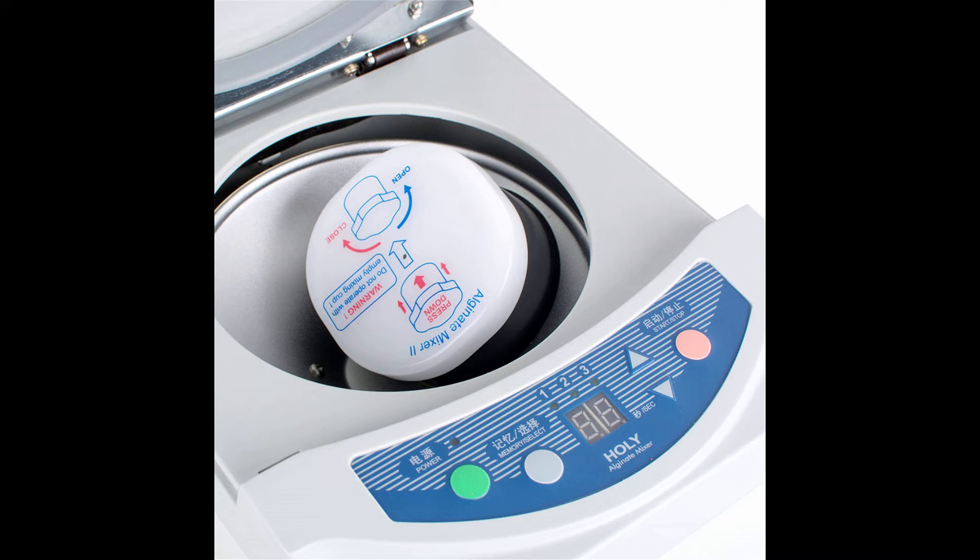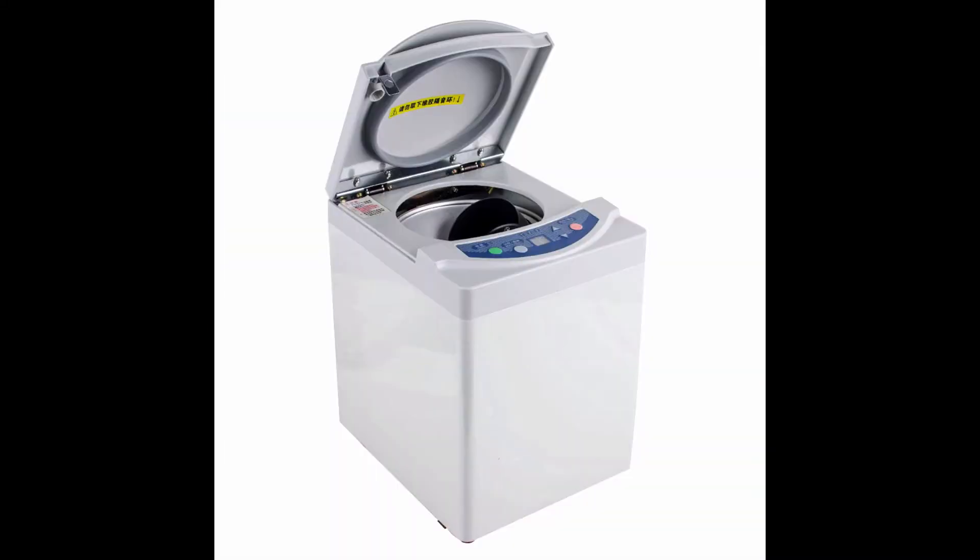The effective inner temperature control system offers good performance and won't affect the material mixing after long-time use. The whole alginate mixer is made of high quality material — it is durable and steady.